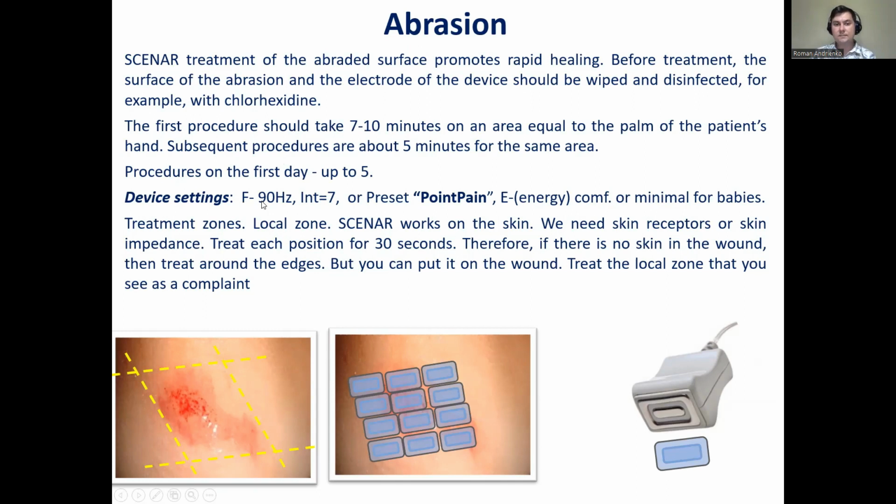Here are the settings. Point pain, or if you don't have this preset, well, this is not that effective, but yet 90 hertz plus intensity 7. And we may either move or do single applications, for example, with the facial electrode here.